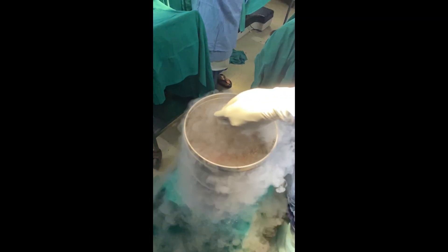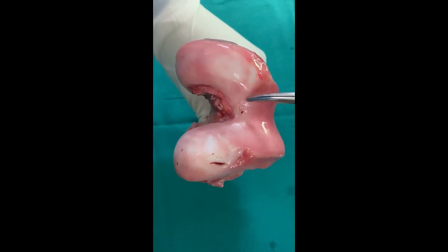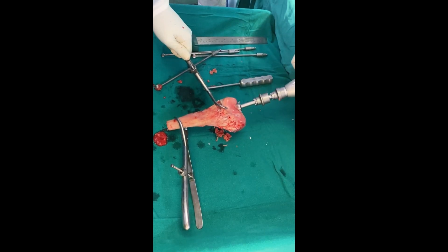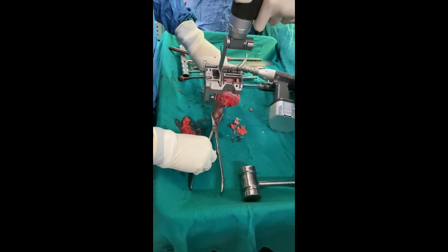Step 3: Bone Preparation. The remaining portion of the distal femur is meticulously prepared to receive the prosthesis composite. This involves shaping the bone to accommodate the prosthesis and ensure a secure fit. The tibia bone is also prepared to accommodate the implant.